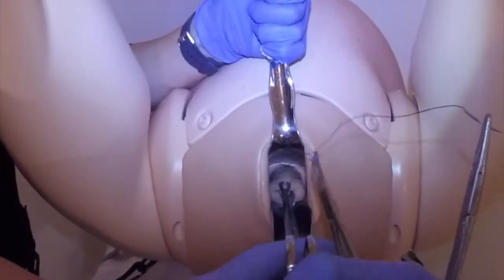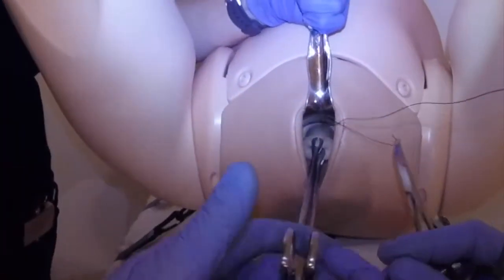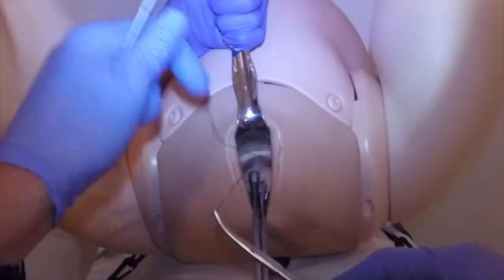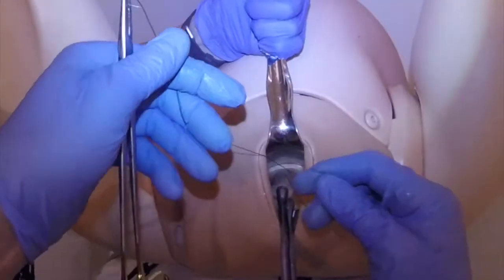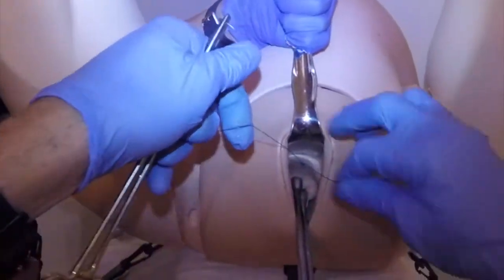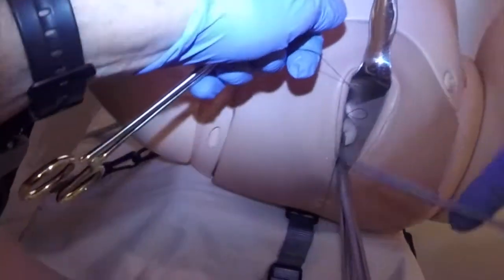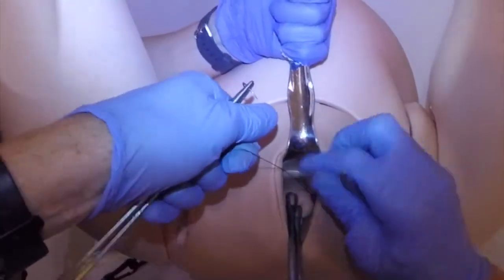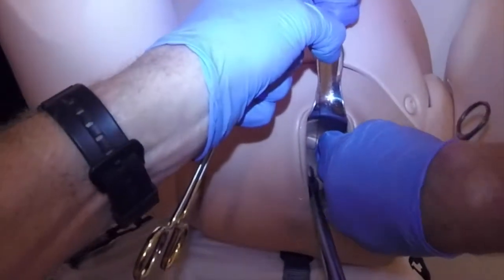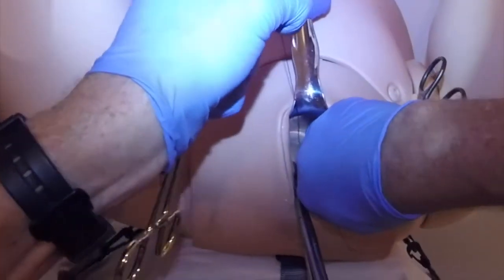I'm now going to take out the posterior retractor and the speculum, and ask my assistant to take this cervix and pull quite firmly — more firmly than she might otherwise feel comfortable doing. I tie a slip knot with two throws in the same direction, run that up loosely, and another throw in the same direction. Because we've been using lubricating gel, I'm just going to hold that with an instrument, and by tying a slip knot and with Daisy pulling a little bit harder, I can make the effect of the knot even higher still. I can feel that tightening up.